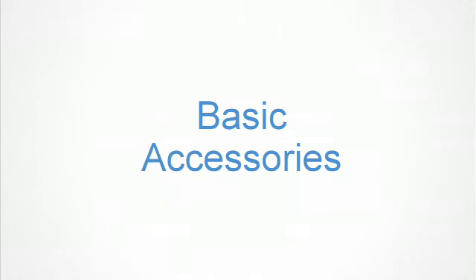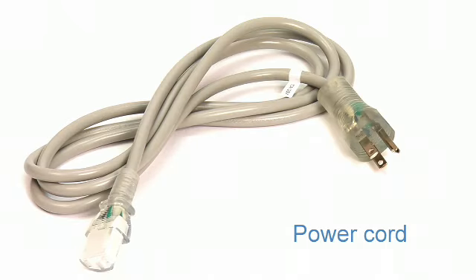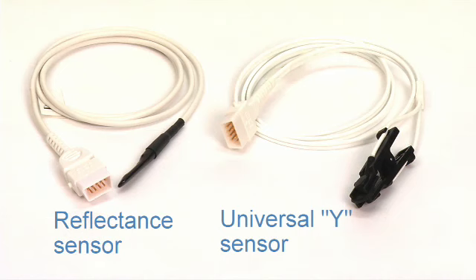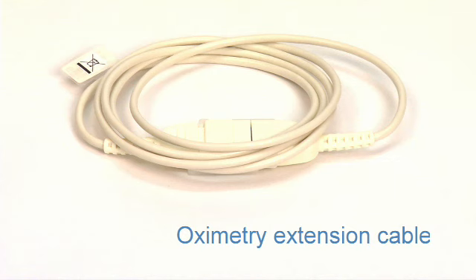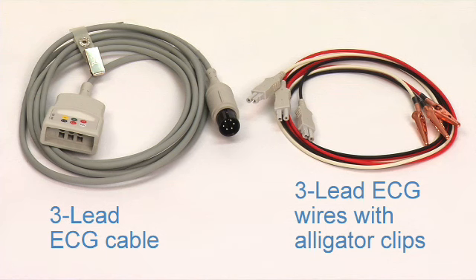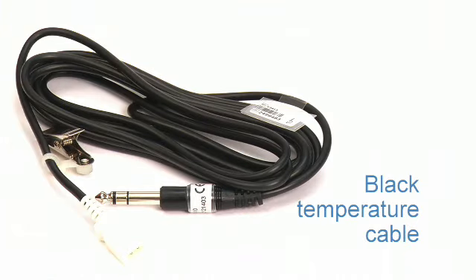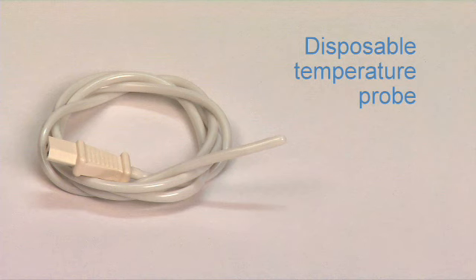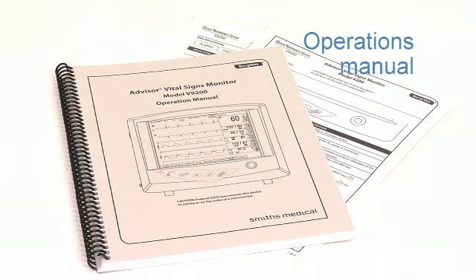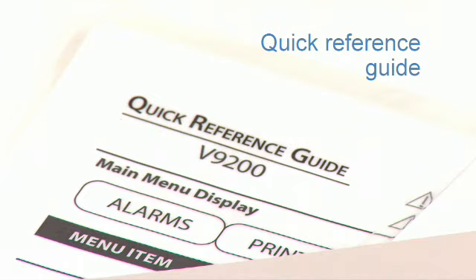The basic accessories included with all models are: an AC power cord that charges the internal battery, reflectance and universal Y-pulse oximetry sensors, an oximetry extension cable, a 3-lead ECG cable and 3-lead ECG wires with alligator clips, an NIBP cuff set, a black temperature cable, a disposable temperature probe, an operations manual, and a quick reference guide.